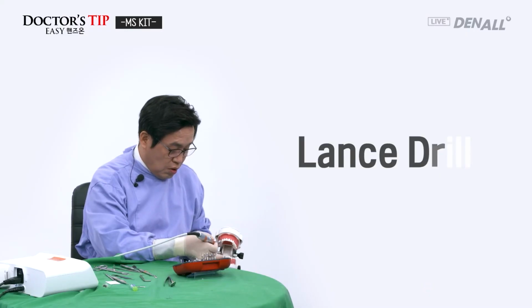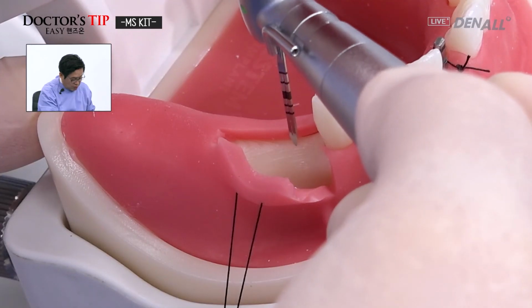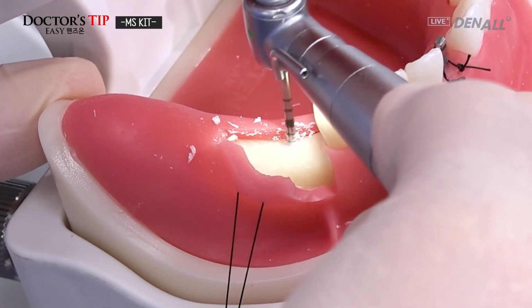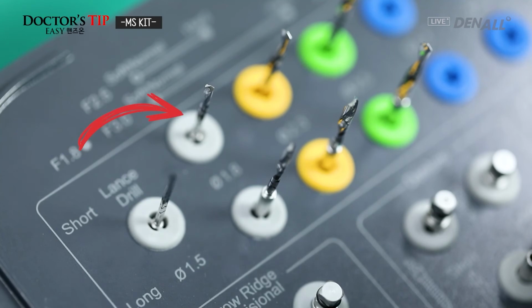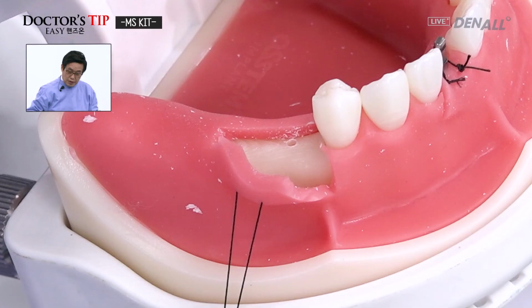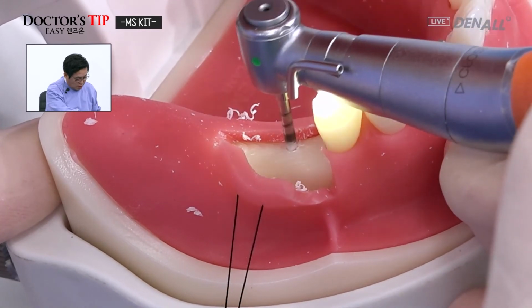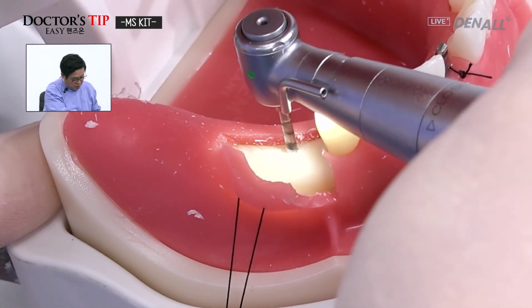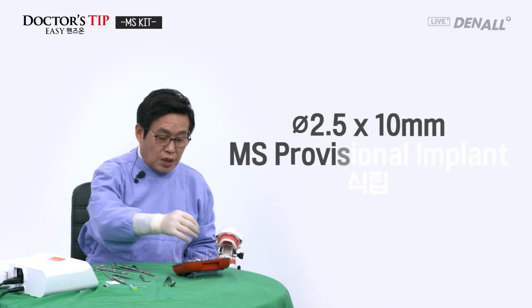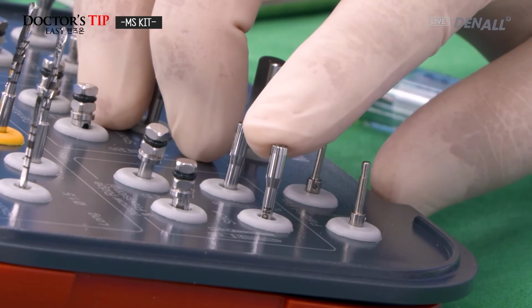Lance drill is used. So after placing implants, I have to put in a provisional, temporary. So I will show you how it's bent. A 1.8 diameter twist drill is used, RPM 1200, like this. So I'm positioning intentionally this way to show you bending. And the provisional MS implant 2.5, 10 millimeters, no mount driver, short type.